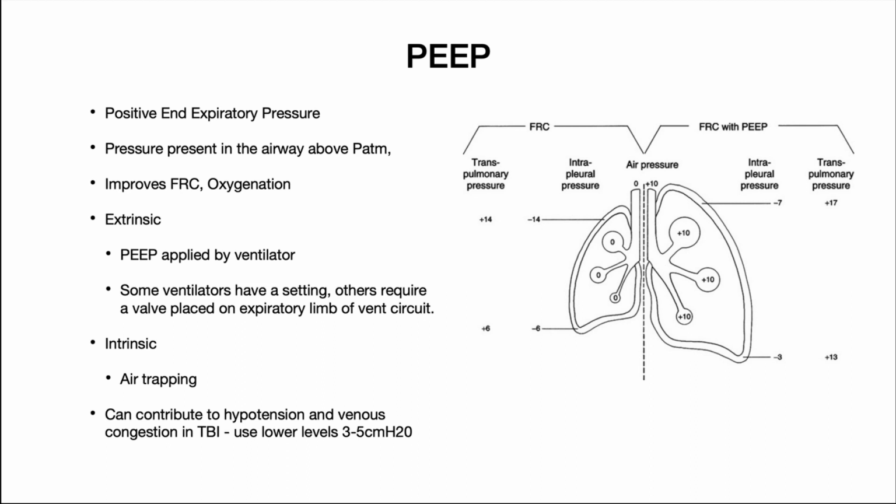One, it increases lung volume in patients who have acute lung restriction in order to improve arterial oxygenation by recruiting or stabilizing alveolar units, and to protect the alveoli against injury during the phasic opening and closing of atelectatic units that produces hypoxemia. It also reduces the effort required for patients to trigger the ventilator or breathe spontaneously in the presence of dynamic hyperinflation and auto-PEEP.